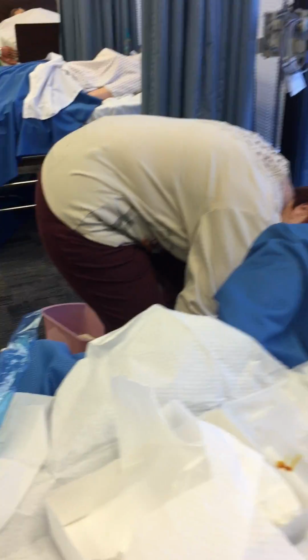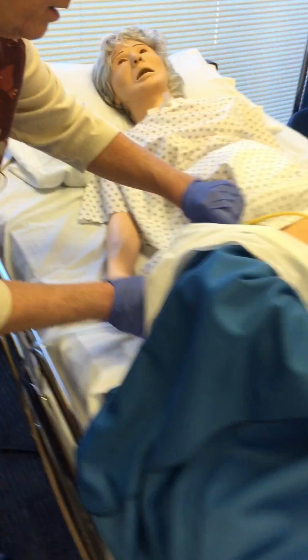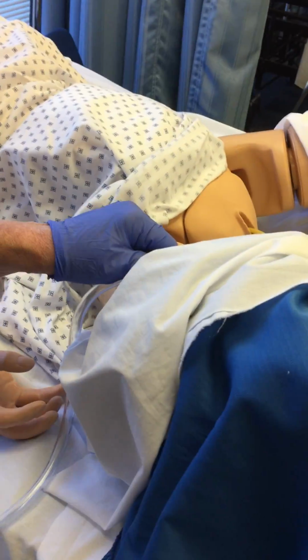One thing I did forget to say, I apologize, before you ever do any of it, you want to make sure this is closed. If not, your urine's going to go out on the floor. This gets coiled on the bed. This, of course, is already attached to her leg. And reposition her for comfort.